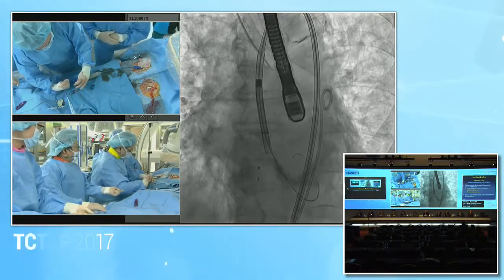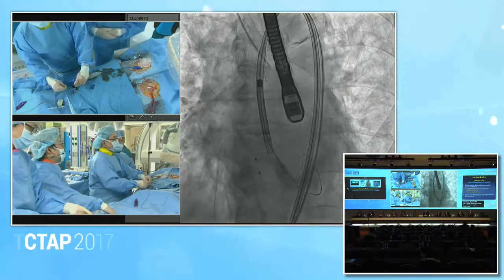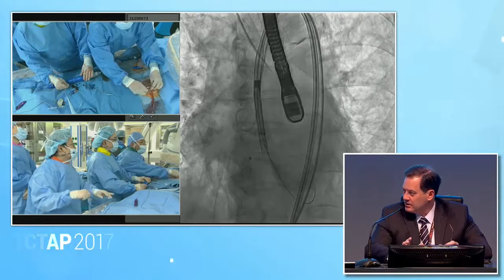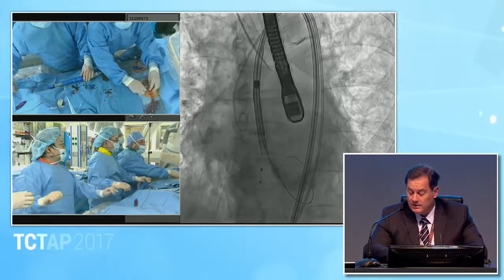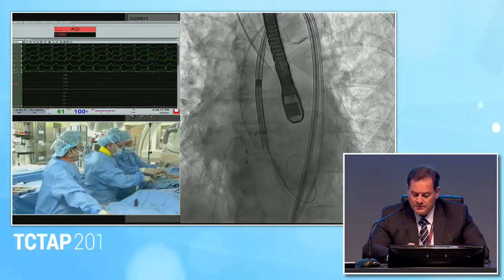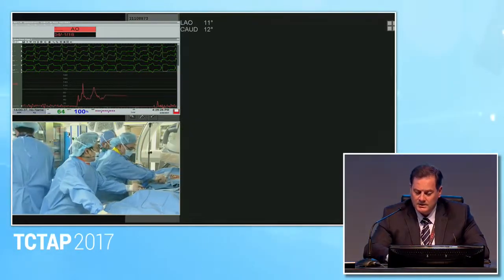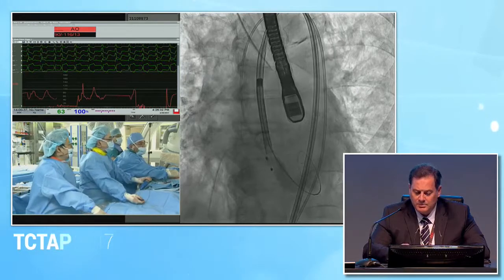Because she has a horizontal aorta and less coaxiality right now. Yeah. That's a problem for paravalvular leak, because if you really don't get that good coaxiality, you'll end up deep on the left coronary side with a leak around that portion of the valve. And this is one of the issues with self-expanding TAVI, in that it can be very hard in a horizontal aorta like this to maintain coaxiality and to get the same depth of implant right across the annulus. And of course that precipitates problems with paravalvular leak.